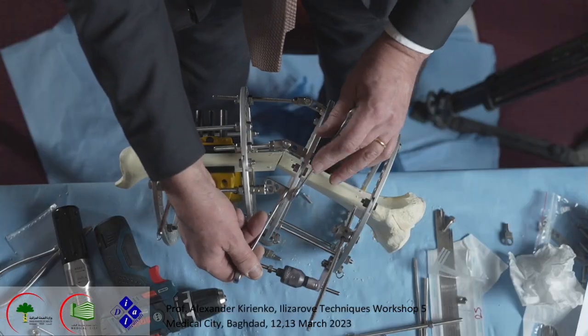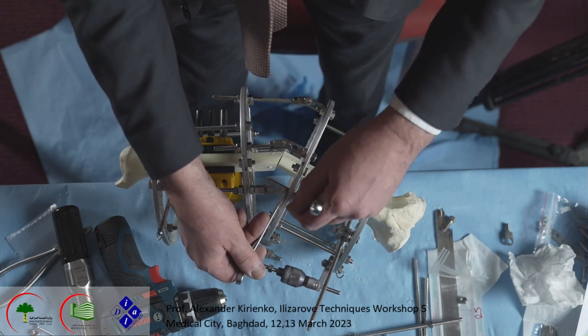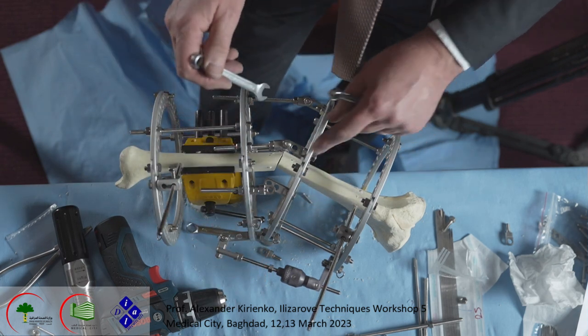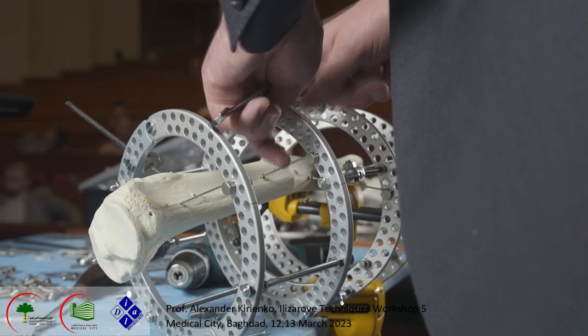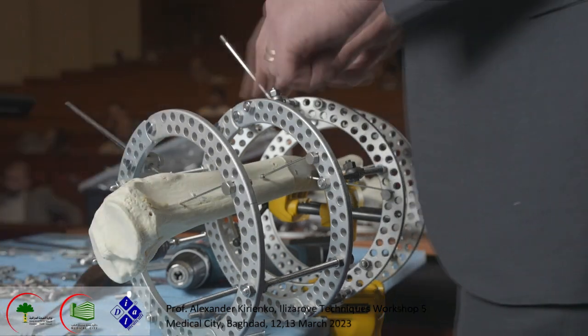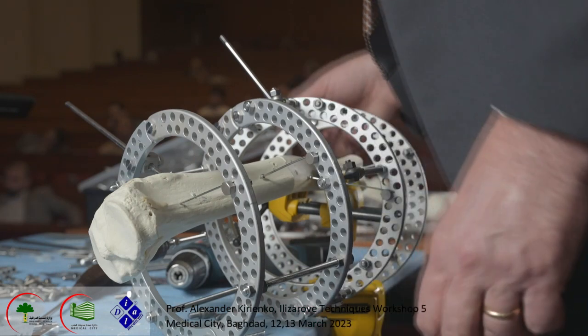We put the bolt here. And see how it's different, a big difference, because with this inclination they are so near that I can't overlap the holes here, because the position of this hinge is not comfortable. Okay, what do we do now?